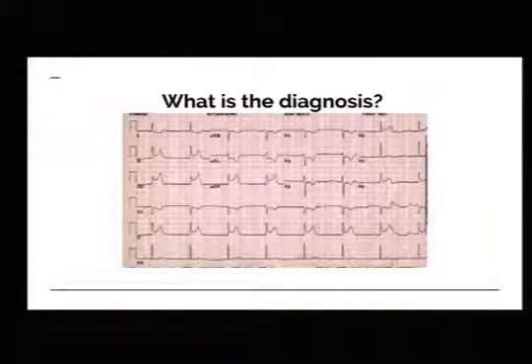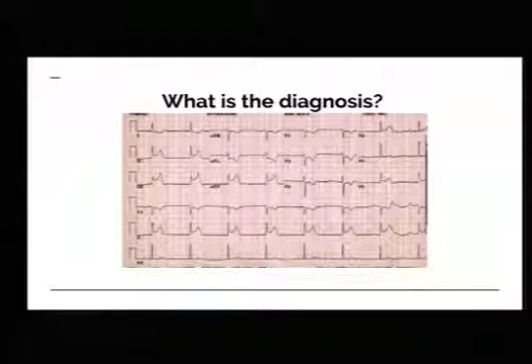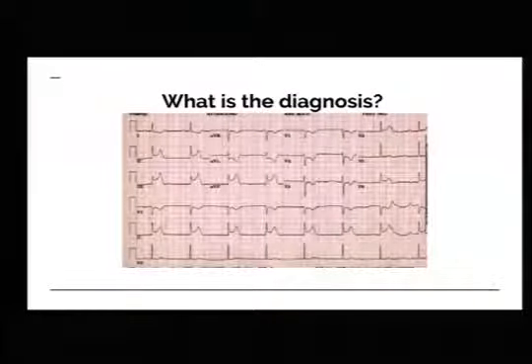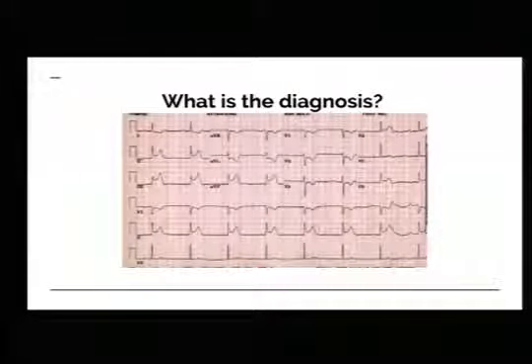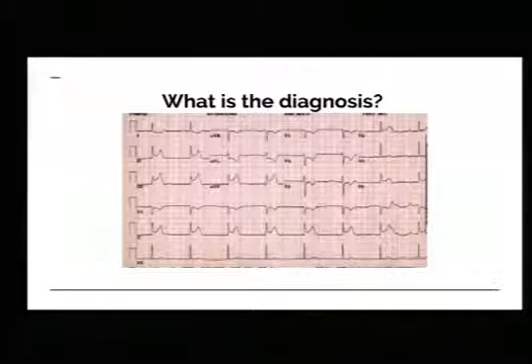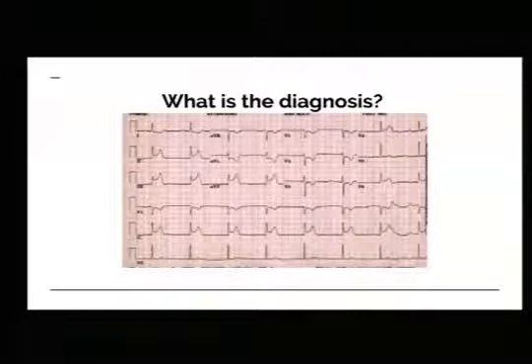So we used to say do a right-sided EKG, which is still in the protocols, which means flip V4 over to your right side and see if you see reciprocal changes there. New literature says nitro is not improving outcomes, and may or may not be helping much with pain in these. So if you have an inferior, you can do the right-sided for your academic purposes. Just don't give the nitro. If it's inferior, don't give it. Because we're not improving their survivability.